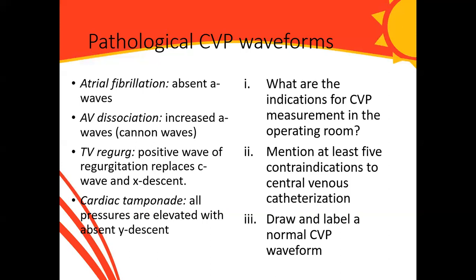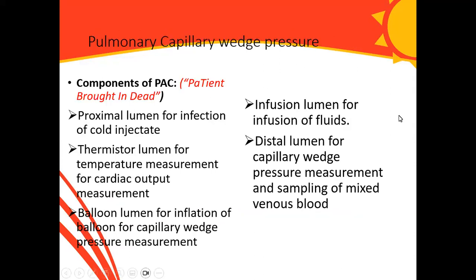All right, so let's go to the next parameter that we'll talk about. So the pulmonary capillary wedge pressure. I remember those days in our training, they would bring a pulmonary catheter for us to identify and to describe the different types. Okay, the components of the common pulmonary artery catheter, you have especially the 5 lumen.